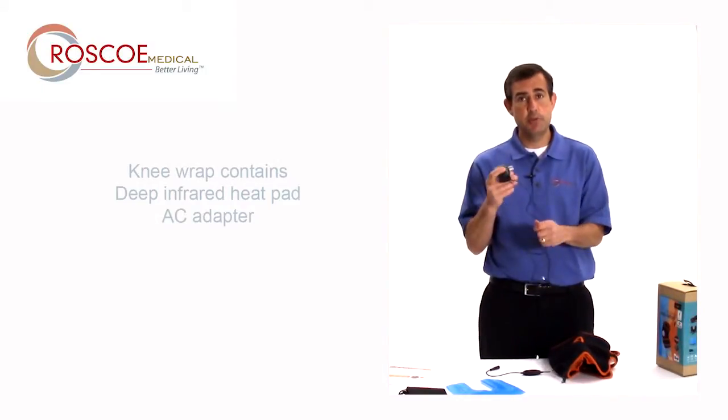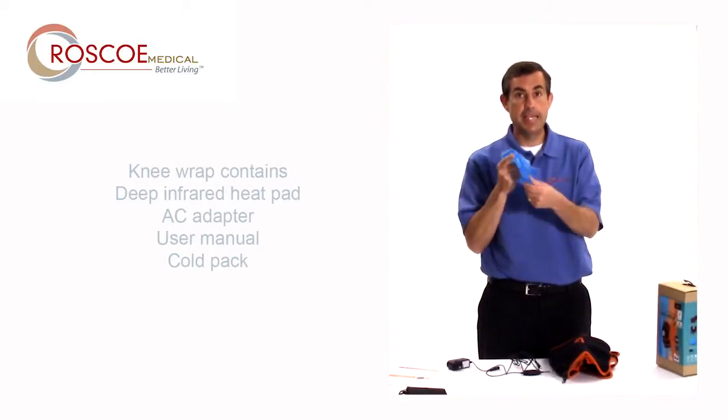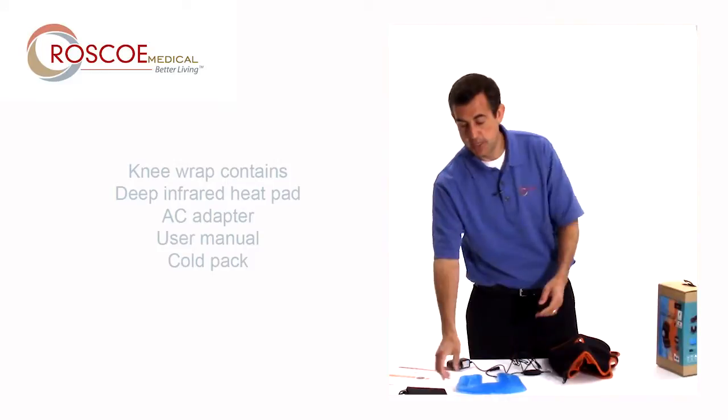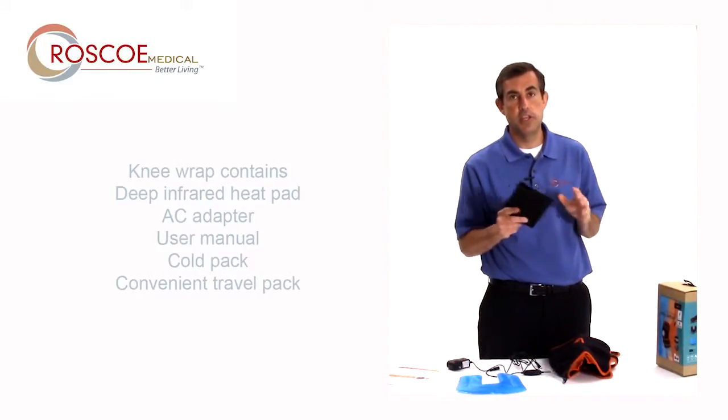Your AC adapter — it won't work without this. A user manual. Your ice pack that fits right inside that mesh. And a little travel tote, because once you start using this for your knee, you're going to take it wherever you go.